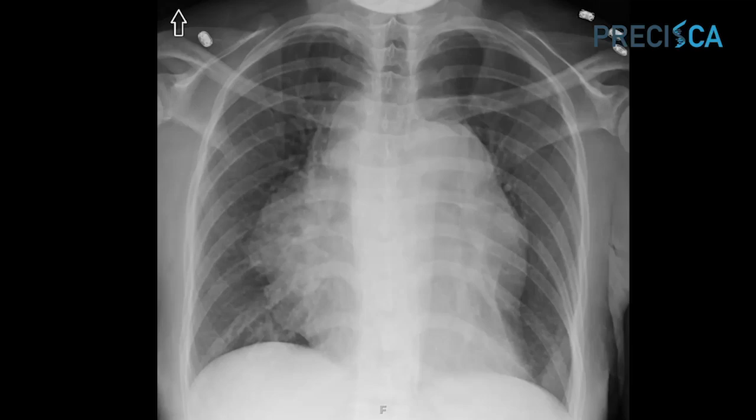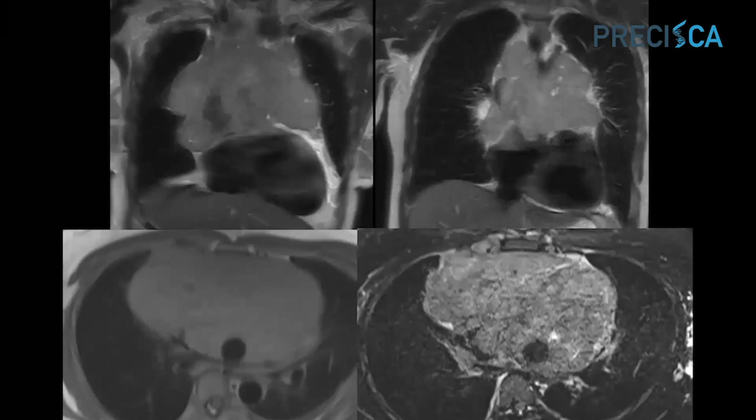But because she was pregnant, there was a desire to avoid doing a CT if that was at all possible. The mother was very concerned about getting the radiation. And because she's pregnant, she's not really a candidate for getting gadolinium. Gadolinium contrast, as a reminder, is a class C agent according to the FDA, and so it's contraindicated in most pregnant patients, with the exception of those where you're worried about a placenta accreta or percreta. So we did an MR to further characterize this lesion.